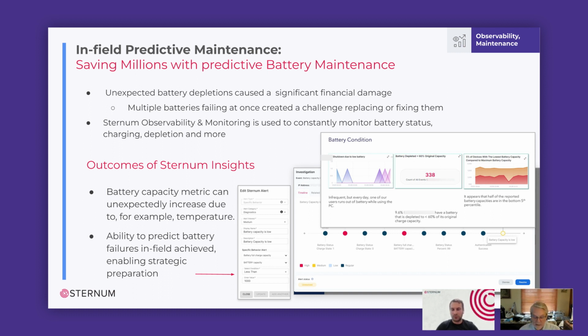Yes, as a firmware engineer, every now and then you learn something new about how your hardware performs. And one of the things that I was startled by with this full charge capacity measurement that was reported up is I expected that it would be linearly decreasing over time, but we saw variability in it where sometimes the full charge capacity would unexpectedly increase. And I wondered at first if that wasn't indicating some kind of problem with the hardware or some kind of fault in the firmware algorithm. And it turns out that when you dig a little deeper into the data sheet, they explain that temperature variations and current draw over time can affect that capacity measurement short-term. So it just helped us understand how to condition the data and not worry about upward fluctuations in the capacity.